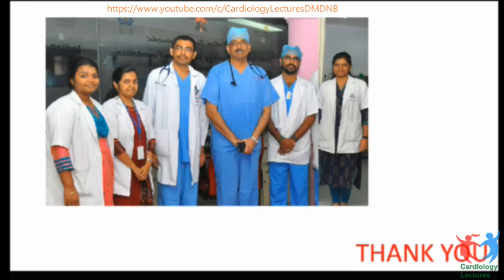This calcific nodule is quite common in the RCA mid because of the torsion, and there is a red thrombus because the fibrous cap is disrupted. How do you differentiate them? Because this is basically basics in OCT. Red thrombus from this calcific nodule. It is very difficult when you have a protruding nodule, that is the eruptive nodule with overlying thrombus. That makes your interpretation very difficult.